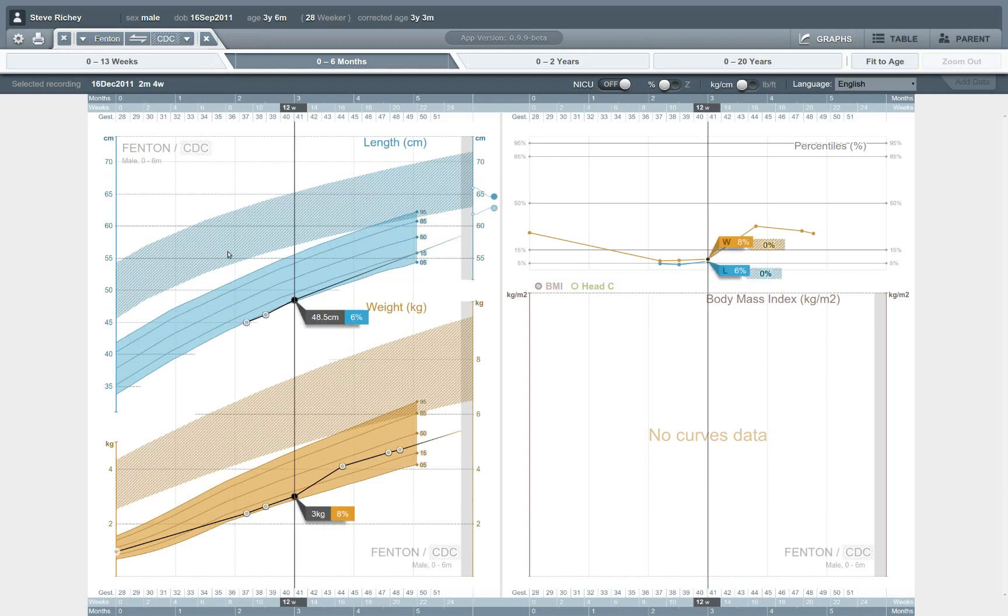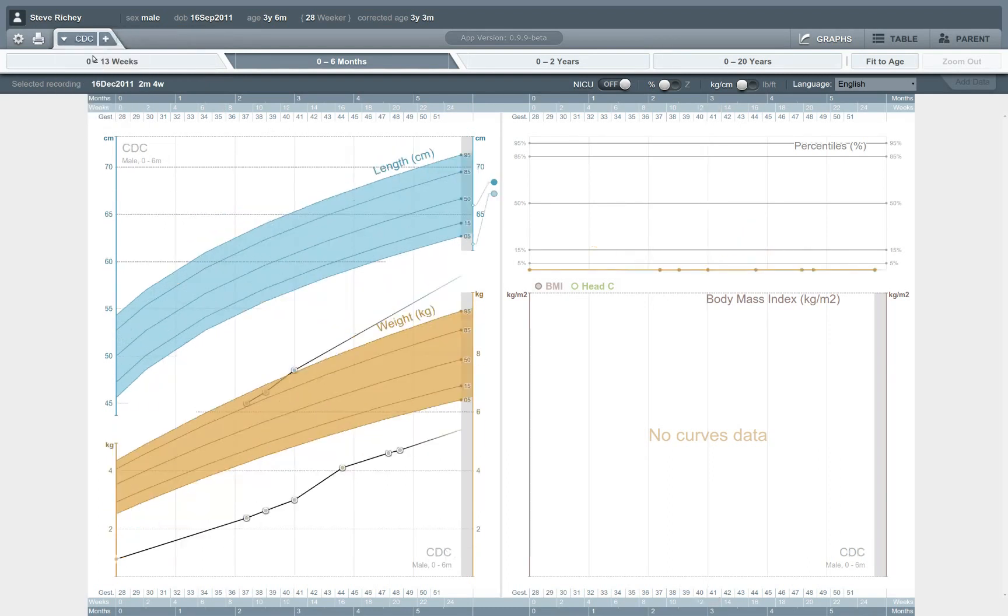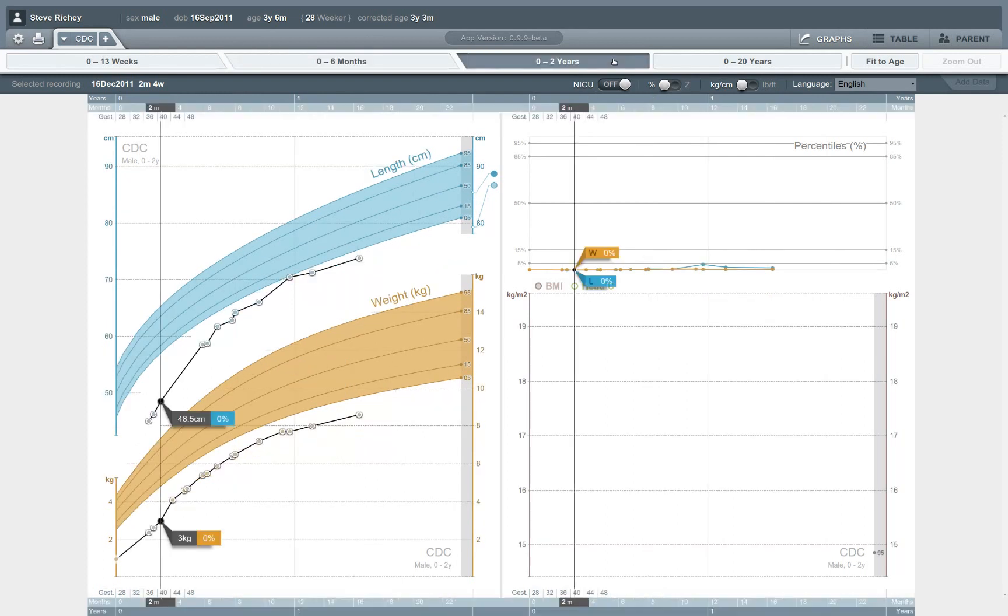So we can look at two different normal value sets at once, or we can change the normal value set that we're using, the underlying curves on which we're plotting these records. And that's another example of an advanced clinical feature that is not available from a paper growth chart and is not available in many of the charts that come built into EHR systems.